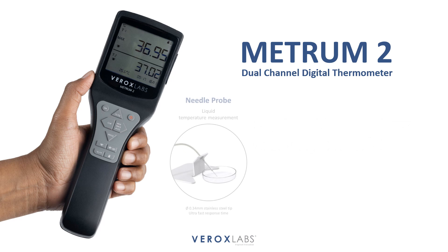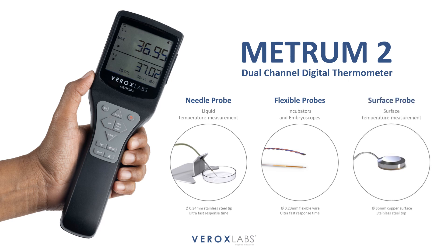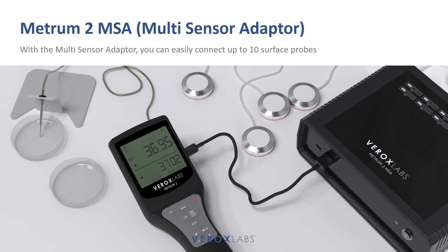This versatile device allows for precise liquid temperature measurements using highly responsive T-type thermocouple probes, as well as surface temperature measurements utilizing a high-accuracy RTD probe. The METRUM2 MSA enables simultaneous measurement of up to 10 surface temperatures for precise calibration of multi-chamber incubators and accurate measurements on heated work surfaces.